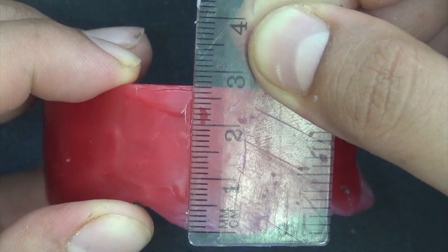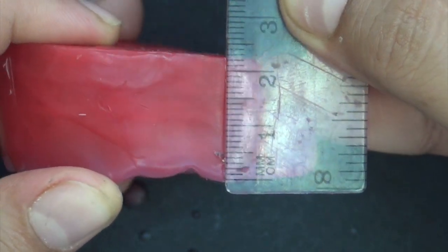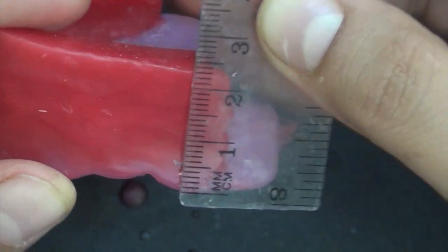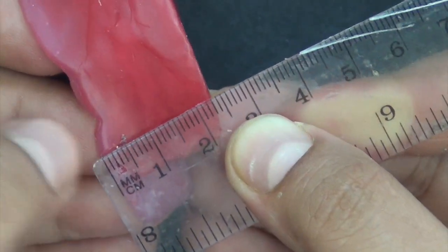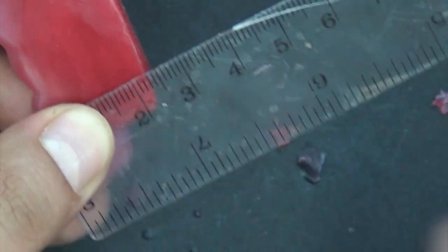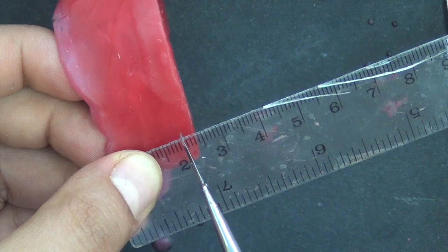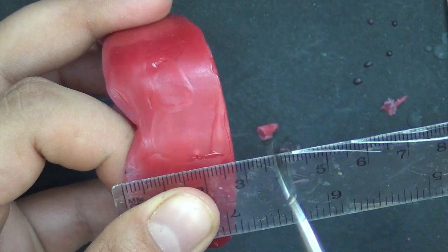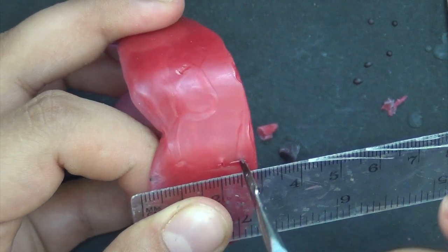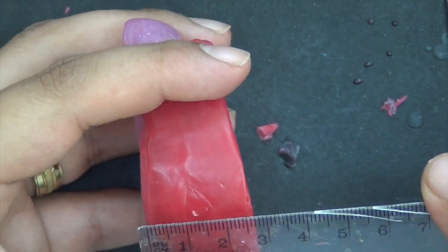Note here that the rim is 27 mm tall anteriorly and 24 mm tall posteriorly, and we need it to be 22 anterior and 20 posterior. So what we're going to do is make it shorter. Mark 20 mm on the rim posteriorly using a carver, and then do the same anteriorly to about 22 millimeters. And do the same procedure on the left side.